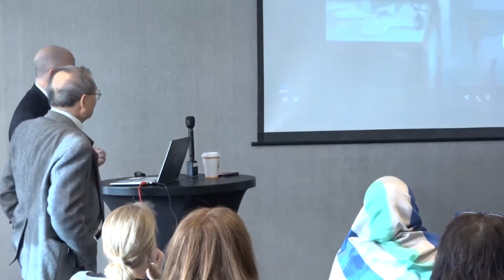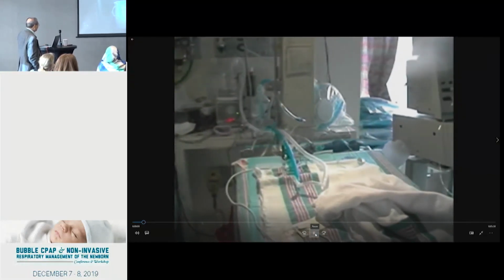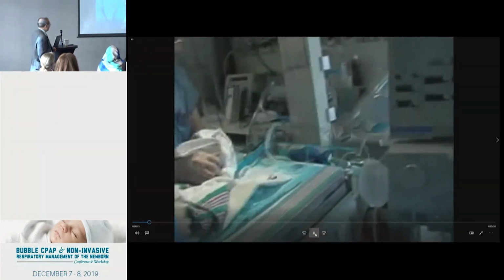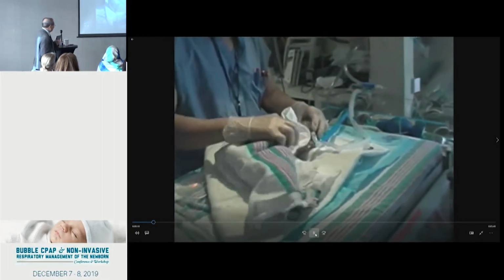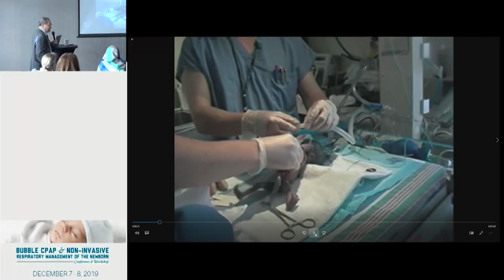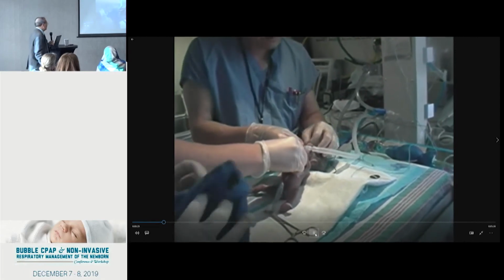This 480 gram baby, okay? So this is our transitional nursery. We know this baby is coming, so we prepare. But sometimes we have a patient from the delivery, the bed, we bring here, we resuscitate. So this baby kicking, moving like that, he can do that, he can breathe. So give him a chance.